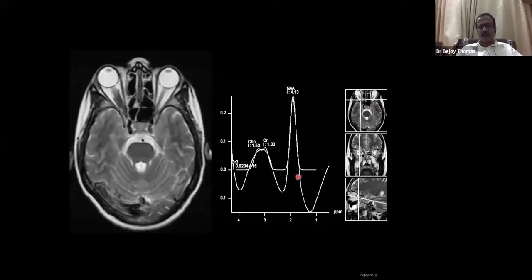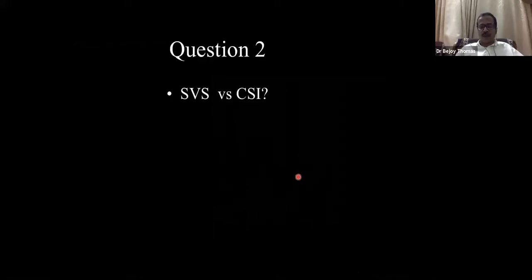So it is not possible to report on these things. This is where you should understand that when you don't get a good spectrum, it is better not to report on that spectrum rather than making a mistake.